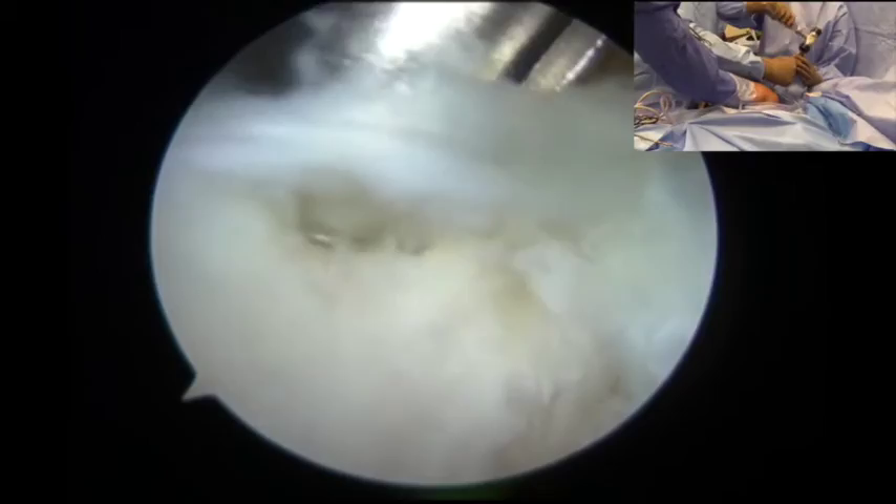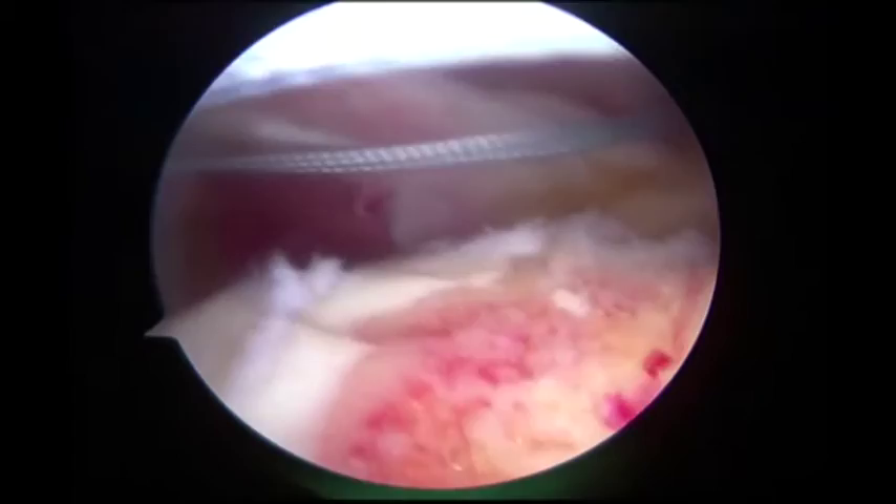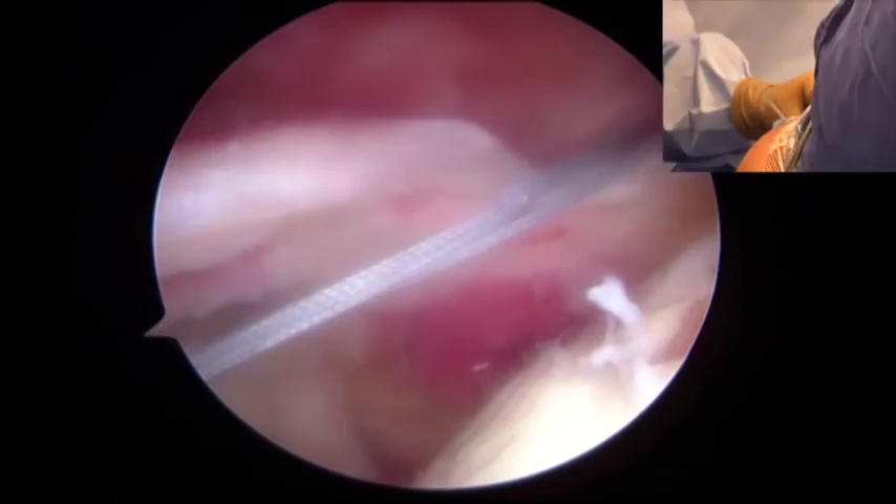This was a 3-millimeter anchor, single-loaded with a non-absorbable suture. The second anchor was similarly placed at the 11 o'clock position and brought out through the anterosuperior portal.